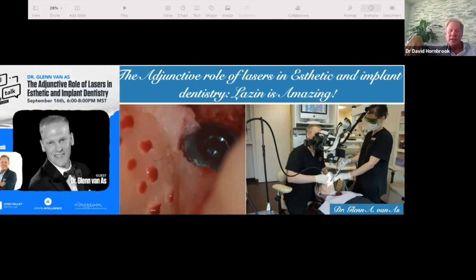So she drove down, and sure enough, it was zirconia. And like I said, the artistry of the ceramics was absolutely amazing. So I told her, I said, I might break it. I was trying to get it off, but I'll do my best. And it took me about 2 minutes, because on the crowns, you have to go facial and lingual and try to go interproximally. We were able to pop that off and re-cement it.